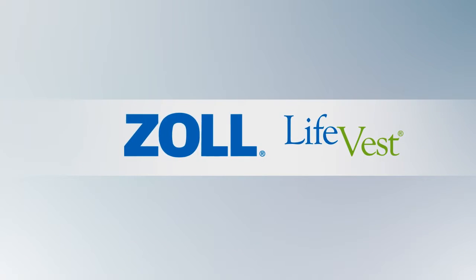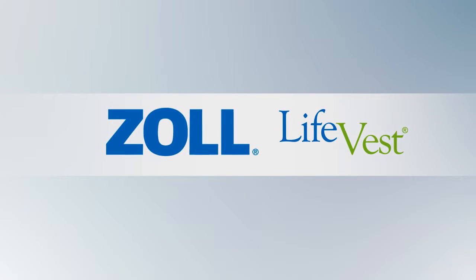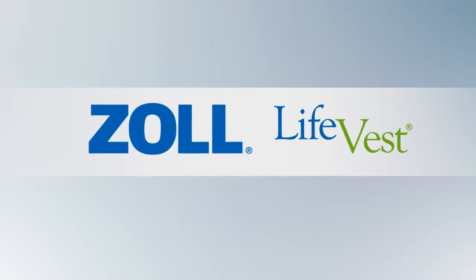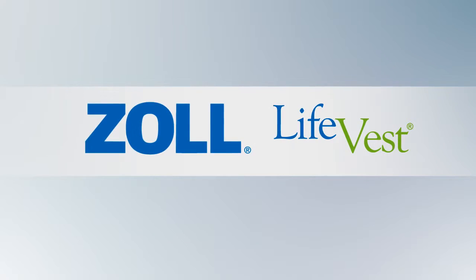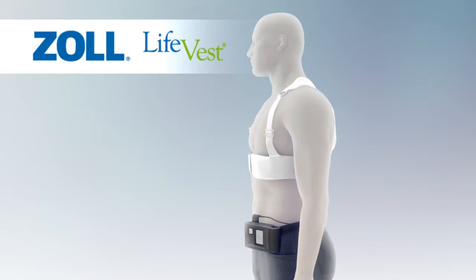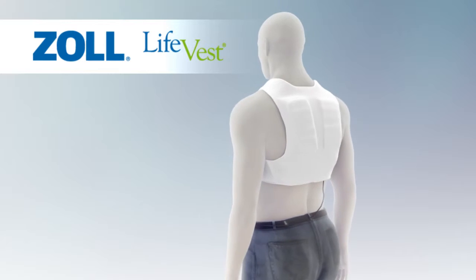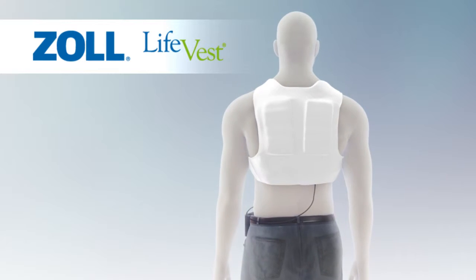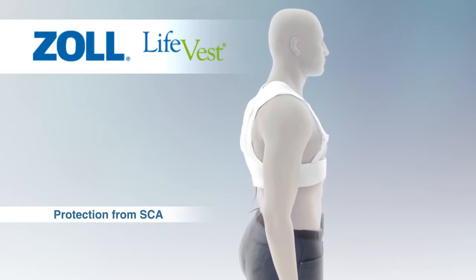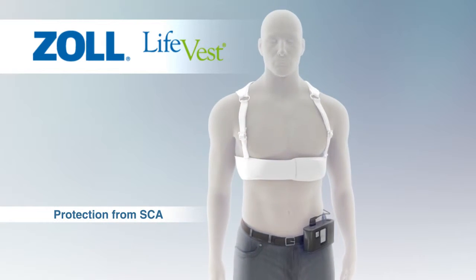The following video will provide a brief overview of the LifeVest wearable cardioverter defibrillator, and includes information that will be important for you to consider in the event that you encounter patients wearing the device. LifeVest is a wearable defibrillator that offers at-risk patients protection against sudden cardiac arrest. Unlike an implantable cardioverter defibrillator, the LifeVest is non-invasive and is worn outside the body rather than implanted inside the chest.